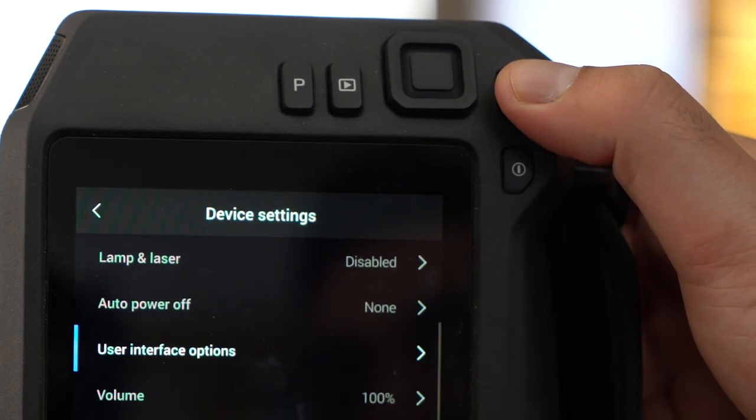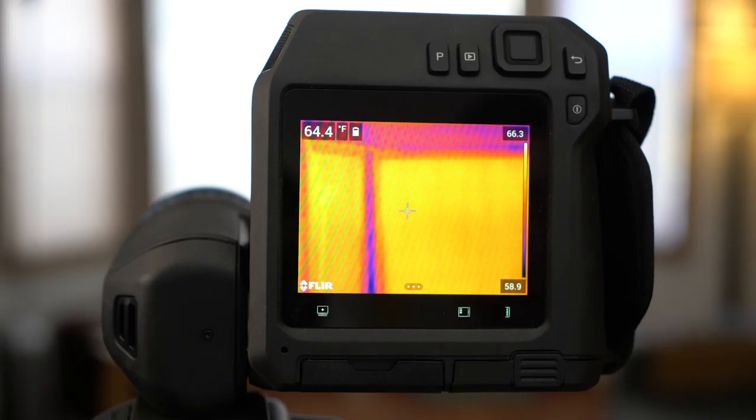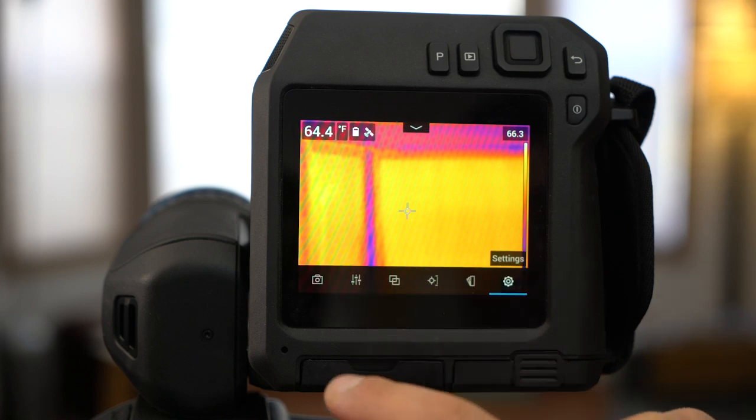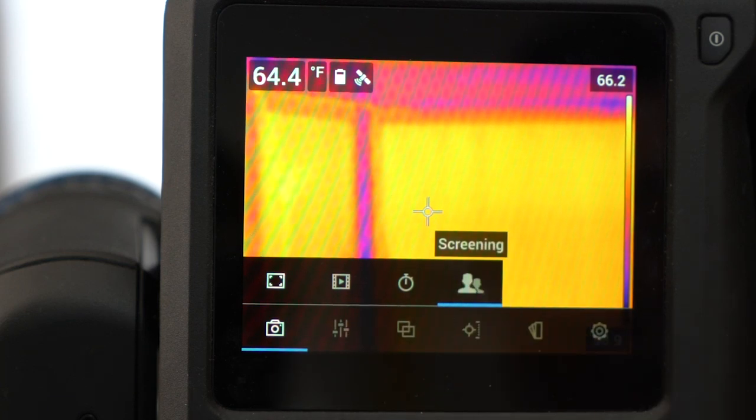Click the back button to exit settings. Now we need to set the imaging mode to screening. Tap on the screen to bring up the menu, click on the camera icon on the far left, and select the screening mode icon on the far right.